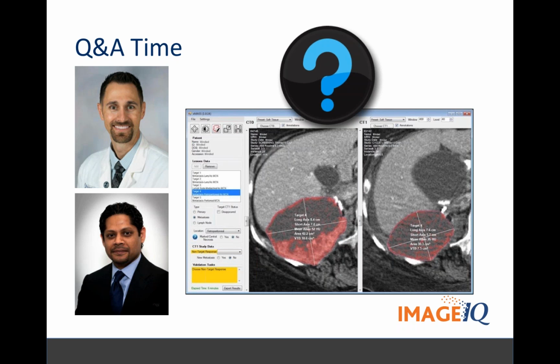Most CNS lesions are going to be using MRI, most likely, when they're asking that, and this has not been adapted to that. It's absolutely amenable to that, and that's actually one of the next steps that was listed on Amit's slide. We're talking about multimodality. That's where we're headed. So it certainly could do that. Again, it's not volumetric yet either, but that's also a next step. So we couldn't do it today, I guess is the answer. But if someone wanted to head in that direction, yes, we can build that. That's in our upcoming plans for sure, because I think this would be applicable to that.